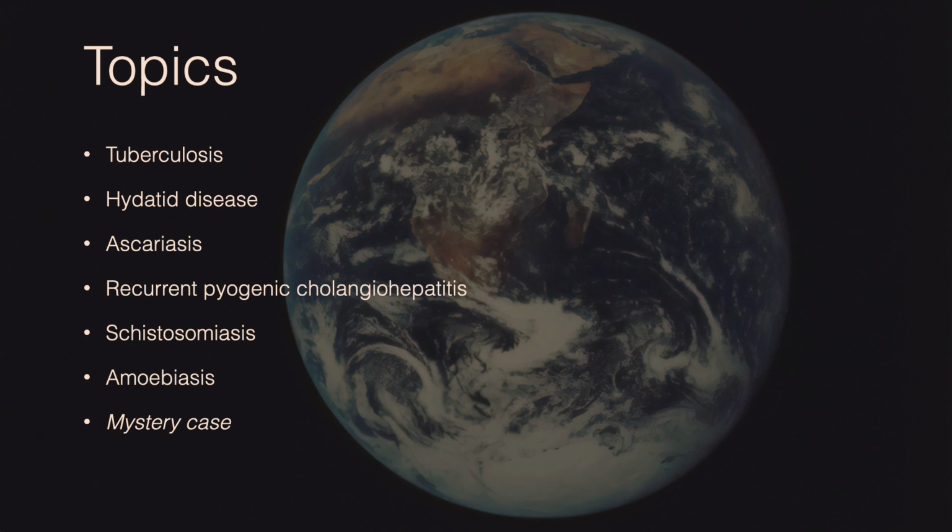Depending upon your practice setting, this may be the only time that you see these diagnoses, or perhaps you encounter them on a daily basis. While these are not commonplace in my practice in the US, I personally have come across many of these diagnoses in the global health work that I do in rural Kenya and Peru. So let's go ahead and get started with the cases.